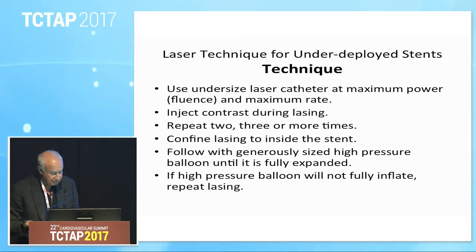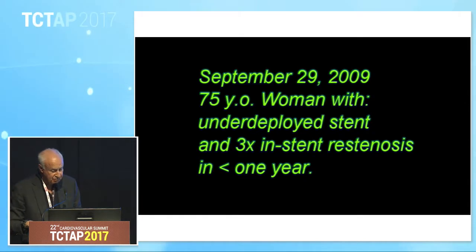We follow with a generously sized high-pressure balloon until it's fully expanded. If the balloon will not fully inflate or expand, then we repeat the lasing. This is a woman I did 7 years ago with this procedure.